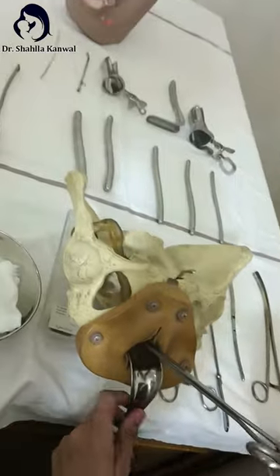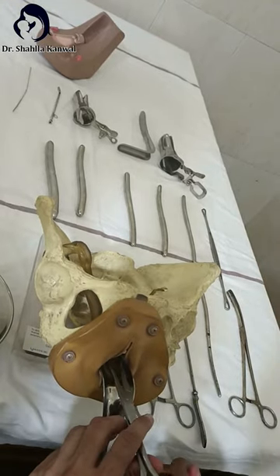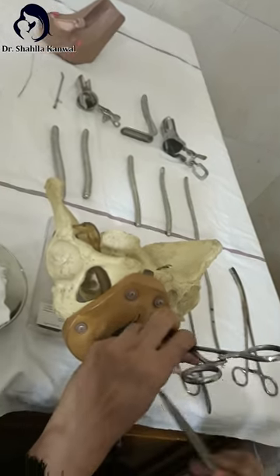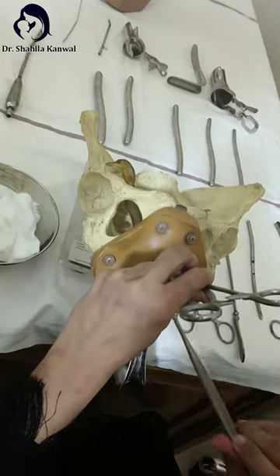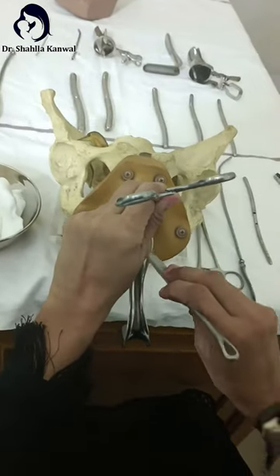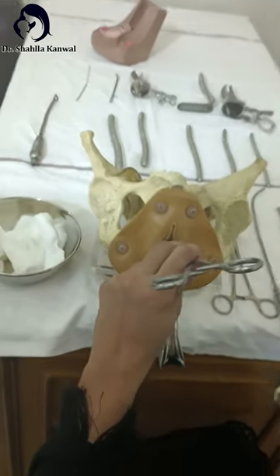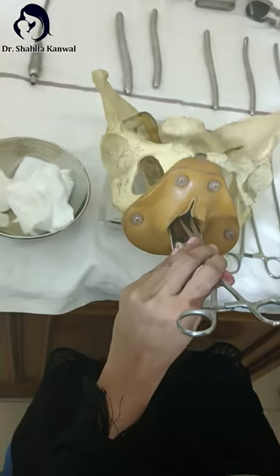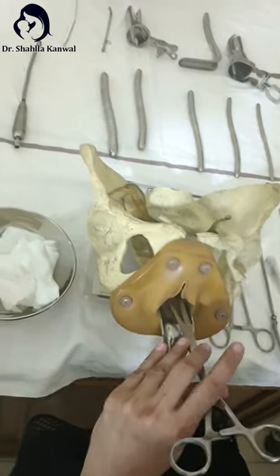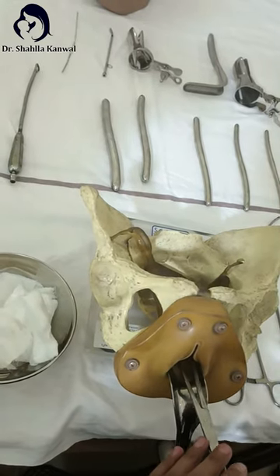How do you confirm the uterus is empty? You can confirm it when pink froth is coming out, when you feel a gritty sensation as you curette all the walls of the uterus, when the patient feels crampy pain due to uterine contraction, and when you feel the uterus contracting on your instrument. This is how you confirm that the uterus is now empty.